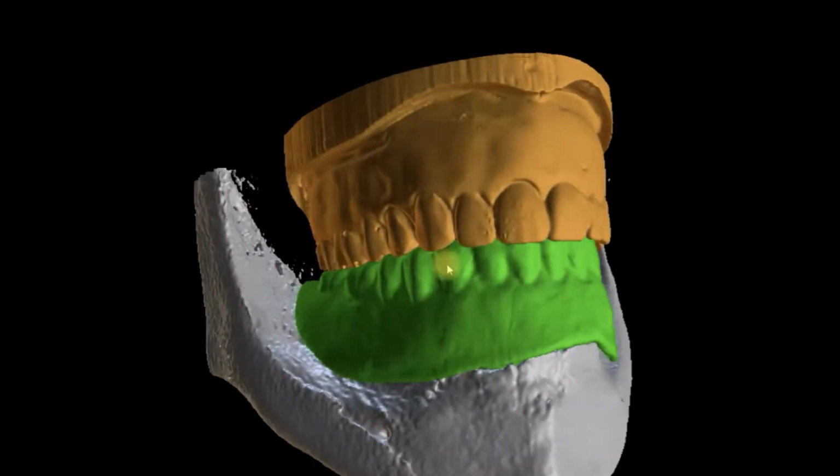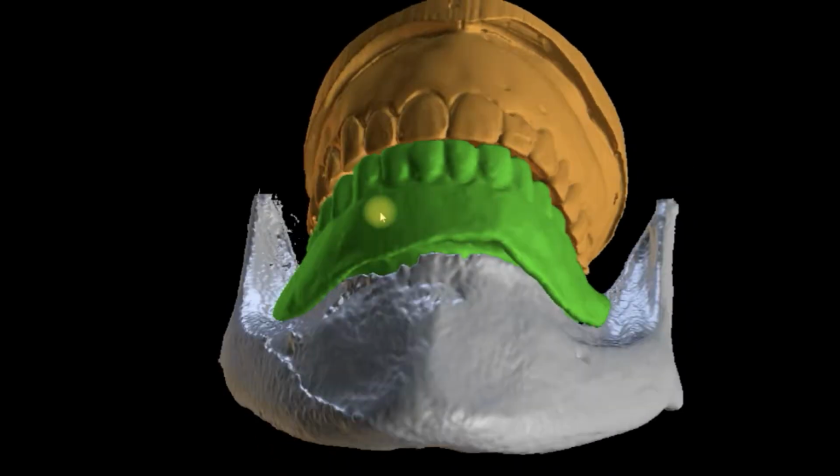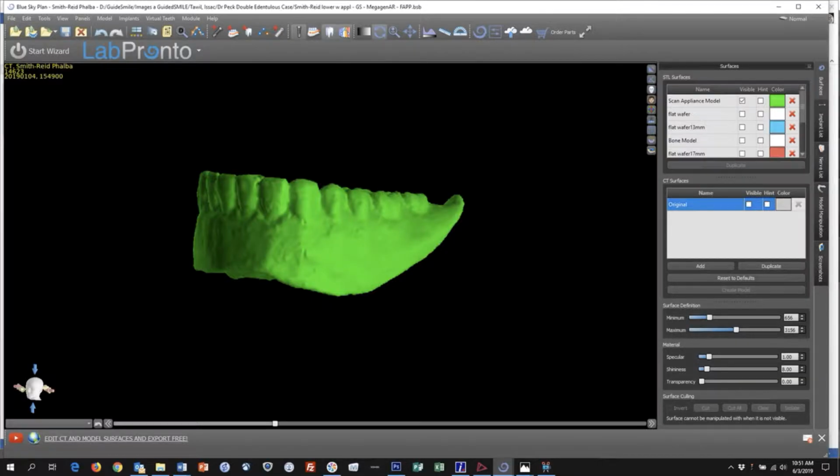Once the scan appliances or the dentures are confirmed to fit 100% and the doctor is happy with the tooth position, then a dual scan technique is performed. This is following the traditional Nobel dual scan protocol, which is scanning the appliance, or in this case appliances, seated in the mouth, fully with no rock, in occlusion. You do not want anything to separate the upper and lower arches. You want the teeth to come together. That's the first scan.